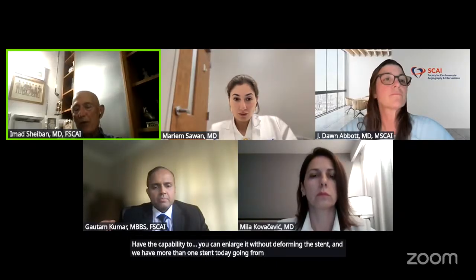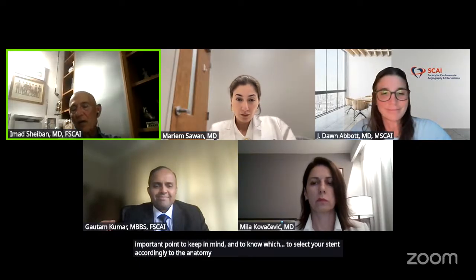Yeah, sure. This is a very important point. I think you should know the stent you are using. You should know the characteristics of the stent. Of course, you should choose the stent that has the capability that you can enlarge it without deforming the stent. And we have more than one stent today going from 3.0 to 5 without any deformation of the stent. So I think this is a very important point to keep in mind and to select your stent accordingly to the anatomy you are treating. All right, thank you so much.